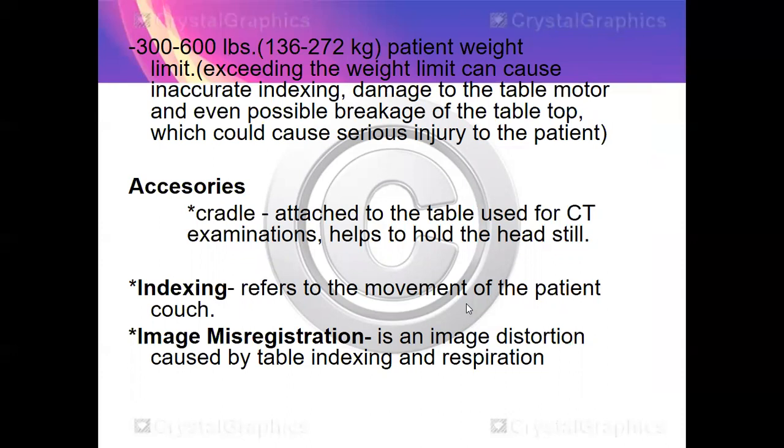We also have the term image misregistration. So, from the word itself, para maintindihan na naman kayo, this is an image distortion because of the movement of the table or the couch and or while the patient is breathing during scanning. So, mali yung magiging image, para may motion artifact siya. Ganun.